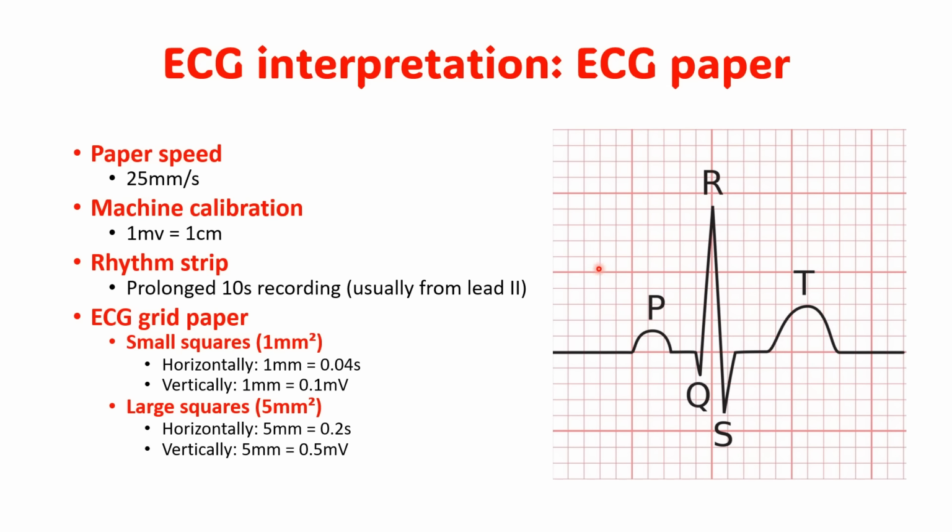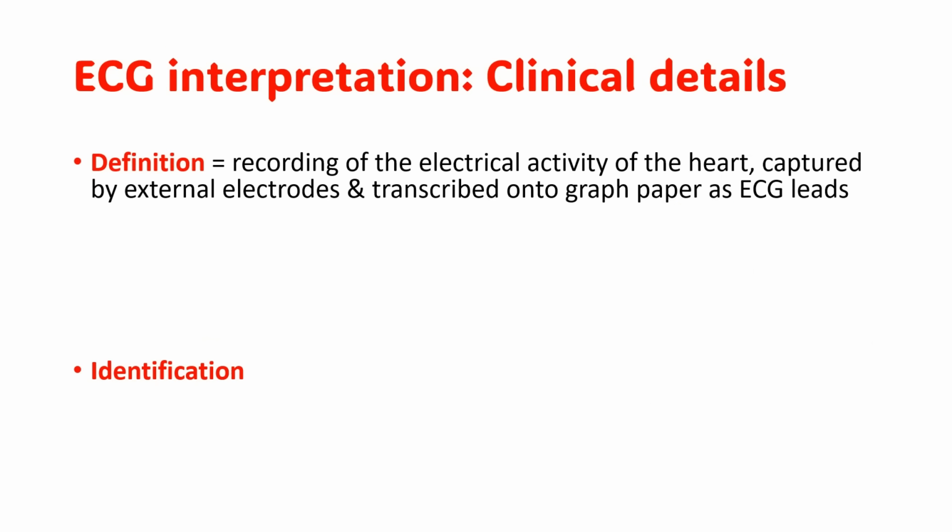And the amplitude of the electrical activity, amplitude is the same as height. These are other clinical details which you want to be aware of when you're recording ECGs. Very important for a hospital setting.